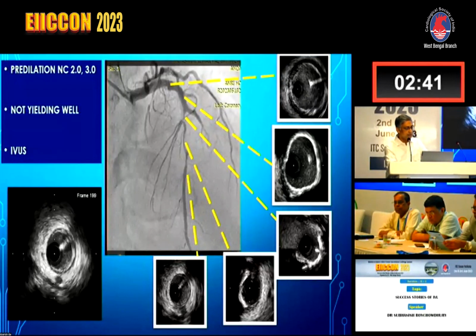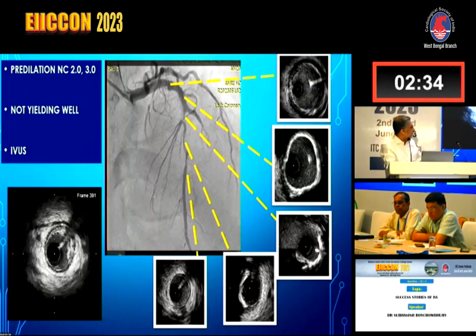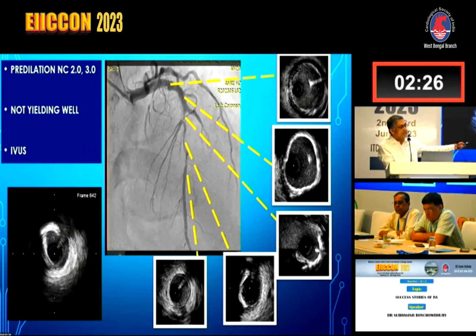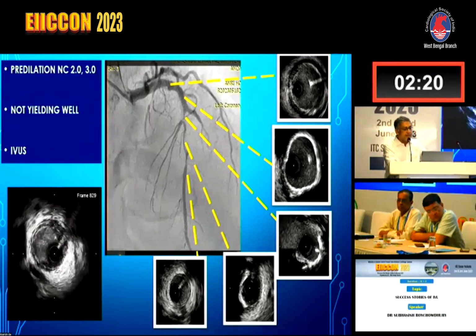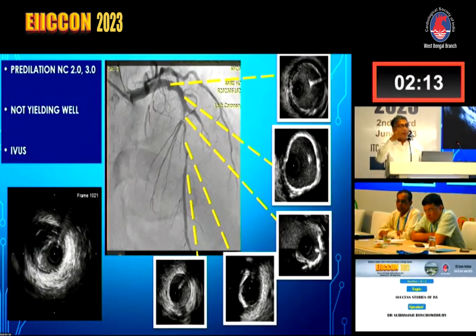I've snapped it for you. So here is the portion where the vessel size is 3. Look at this image where we see the tightest portion of 180 degree of calcium. This is the diagonal part, again 180 degree of calcium, but to our amazement, here we had 360 degree of calcium. So this was the part where we would place the proximal edge of the stent. And proximal to that, it showed a non-calcified ectatic segment, almost 4.5.